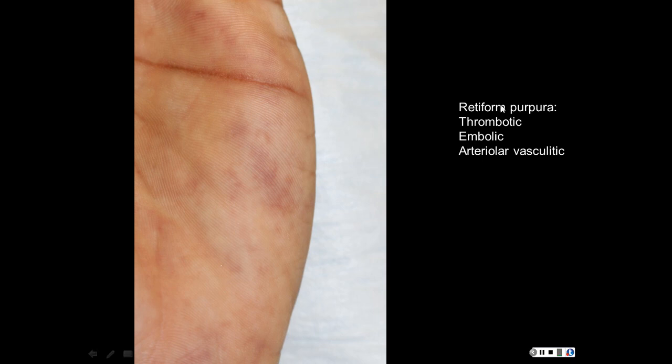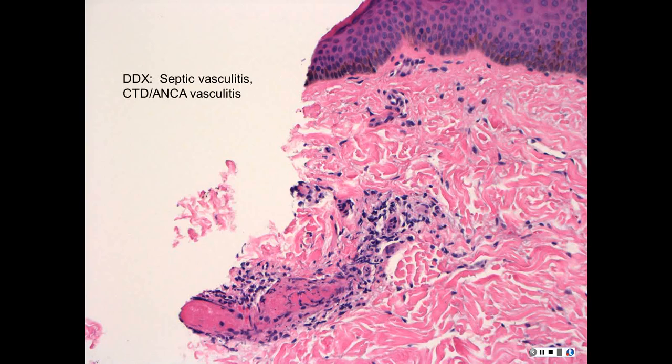And so, you did a very nice job of saying what your differential would have been. And here is your biopsy. Tell me what your biopsy shows. So, tight perivascular. I'm thinking with ANCAs, I'm trying to see, are those granulomas? Probably, there are some lymphocytes, some neutrophils, and some karyorrhectic debris. So I think we make it to a vasculitis.